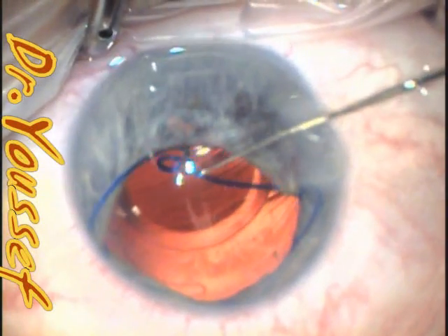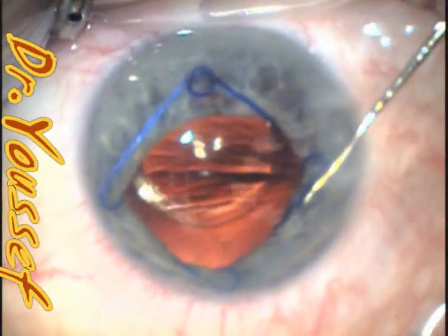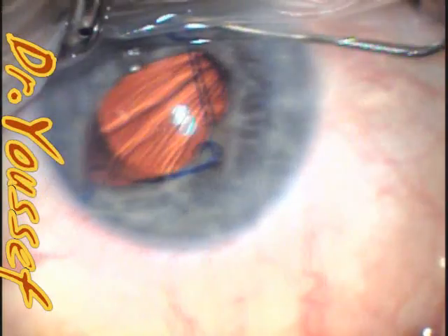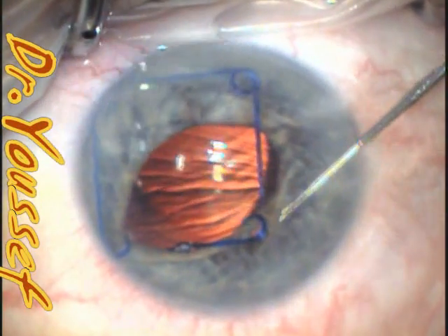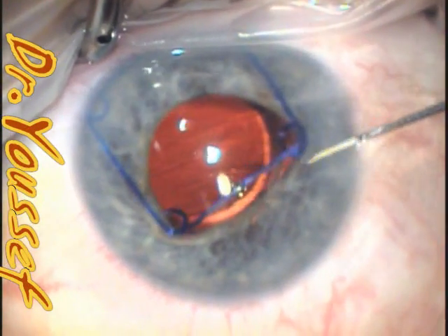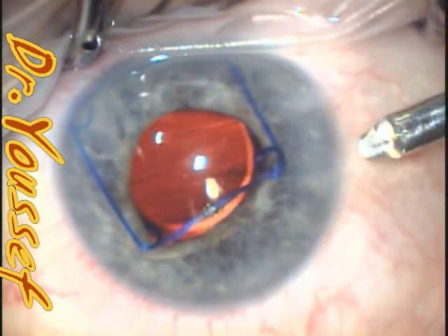This is the mushroom tool, and I disengage the superior ring. Instead of struggling with the sub-incisional one, I'll push the bar centrally to disengage it. As you can see, the ring is rotating out of place and now the inferior one is closest to the wound, so I'll disengage that and position it in a good position against the wound, and I'll use the injector to explant it easily.